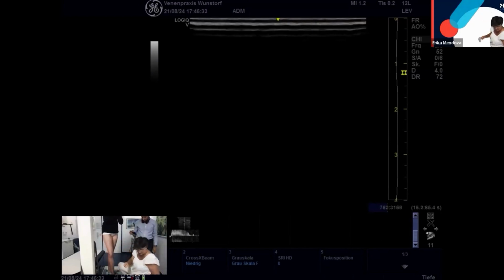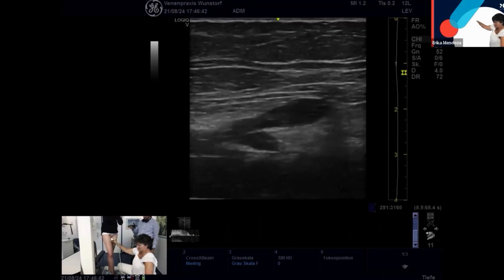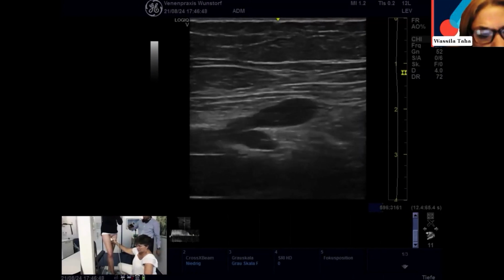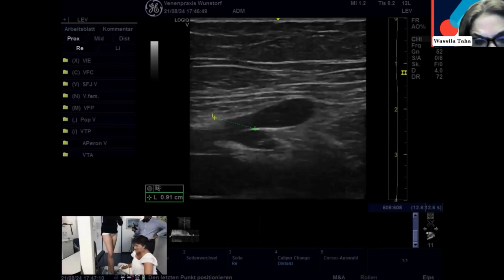Interrupt the perforating vein, from Dr. Sasa. I am quite sure that I pronounce the name very badly. So interrupt the perforating vein, the thigh perforating vein. But if you want to do this properly, you have to go 3 centimeters below the skin, 2 centimeters below the fascia, and you have to interrupt it really at this level, because otherwise you will leave a stump. Yes, you can see it. It's so big. And you have a stump.